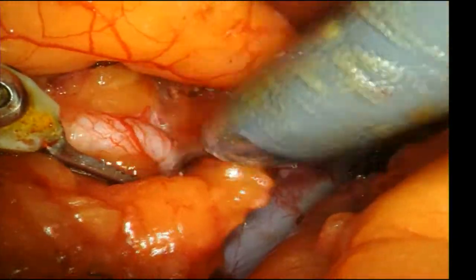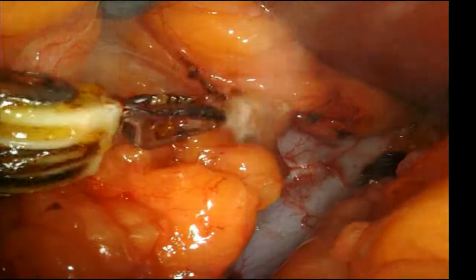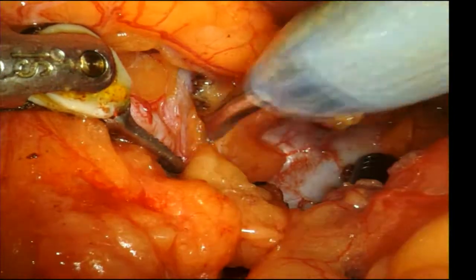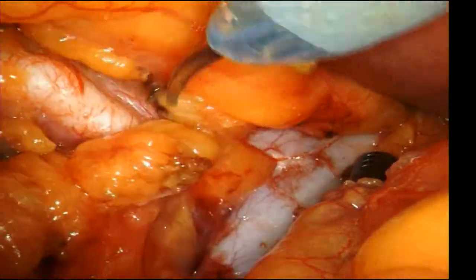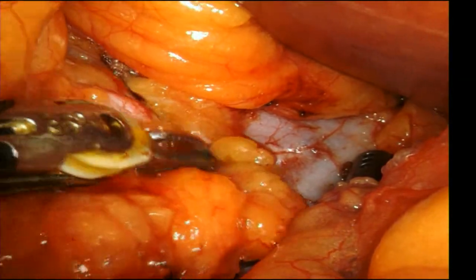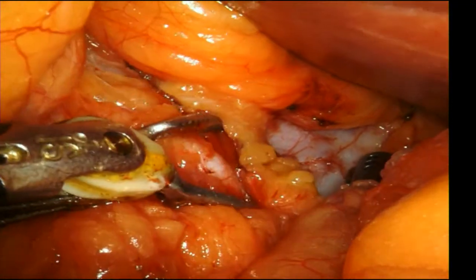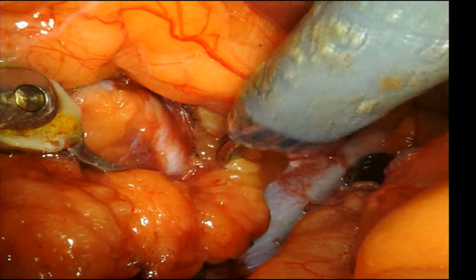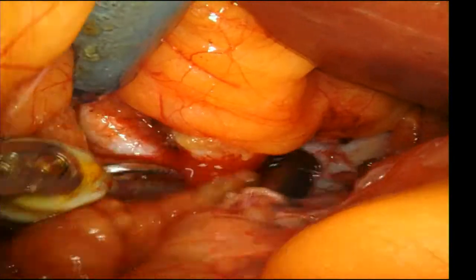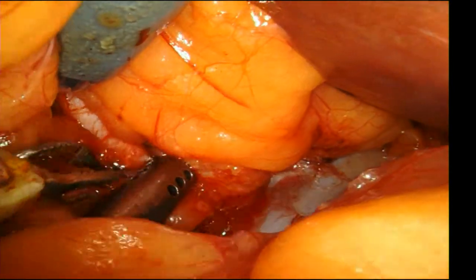We tried to pick some easier ones for demonstration purposes so that we don't get any untoward surprises. Although we could have picked much more difficult masses to tackle, this is a medium difficulty tumor. It's almost 4 centimeters in size, but it's really egg-shaped, which will present some challenges in planning the resection. So it'll be a nice demonstration of the use of the ultrasound to figure out exactly where we need to go.